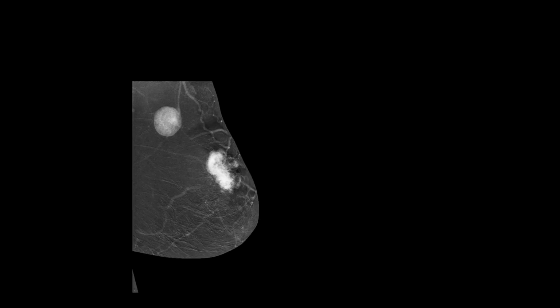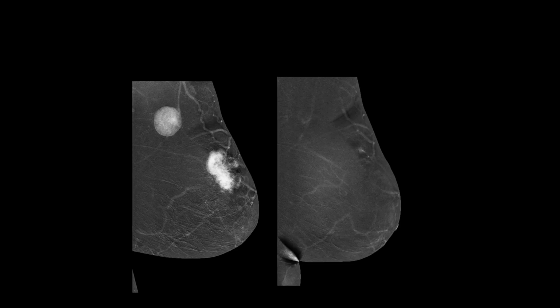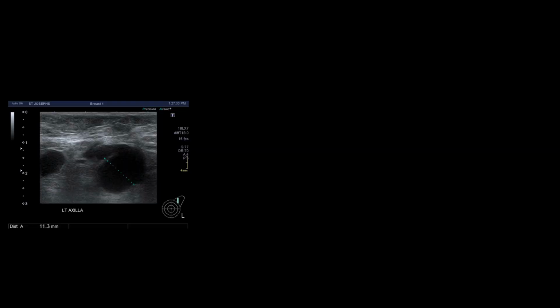Another scenario: a patient who has a palpable lump, a patient with locally advanced breast cancer, in this case because of lymph node and extensive disease, and we do monitoring for neoadjuvant therapy. We see excellent response, but look what we also see: someone forgot to put a tissue marker after the first exam. But we have this, so we can localize that under contrast enhanced mammography and still perform a good evaluation of the residual disease. So it saves us in this case.